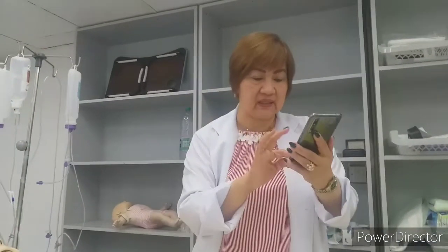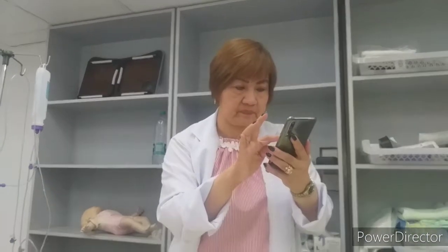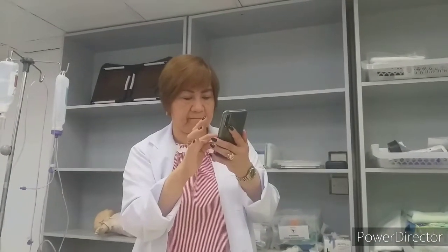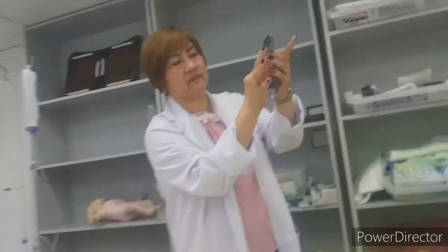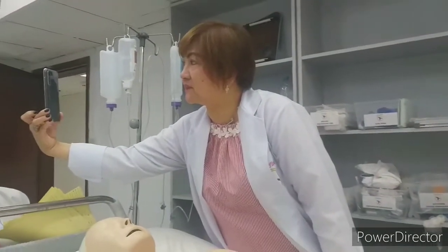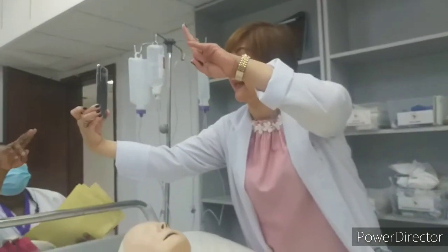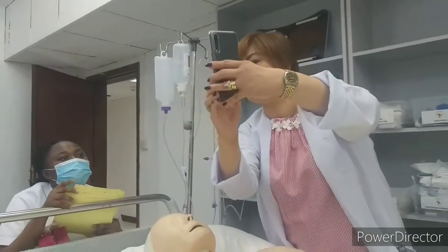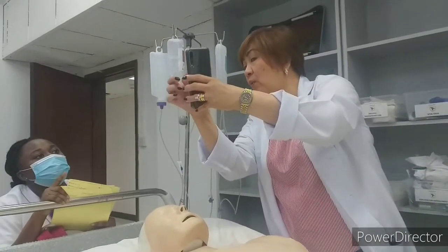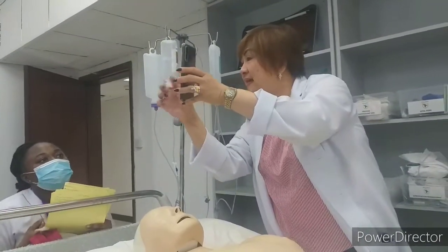So I will be just showing you, this is. Can you see the pen? Yes. Okay, so there are two like this. Okay? So there is a peg. This is where you are going to clean only.